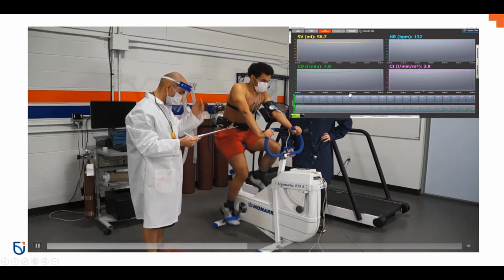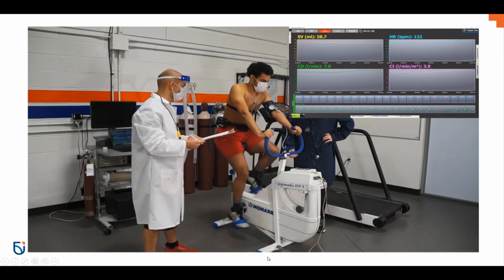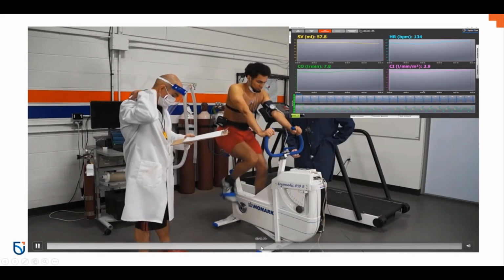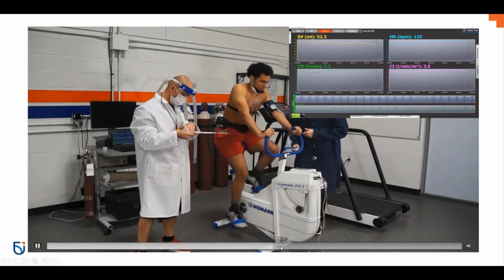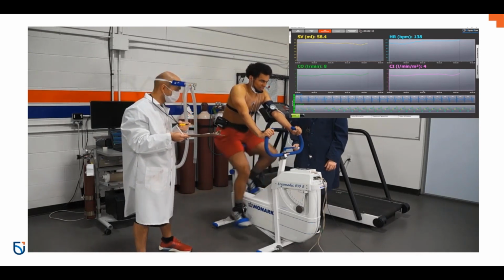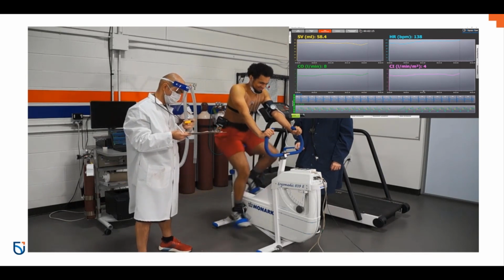So the X scale will get smaller and smaller, and the participant is going to run through his warm-up here, which isn't all that exciting. We can fast forward through that until we get some actual data, because we're not going to change anything here. We're talking to him, making sure he feels comfortable and good, there's no pinching in his legs, the pedals feel good, and he looks fairly comfortable here.